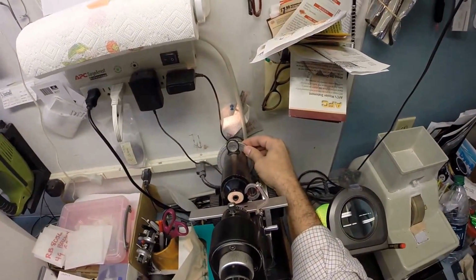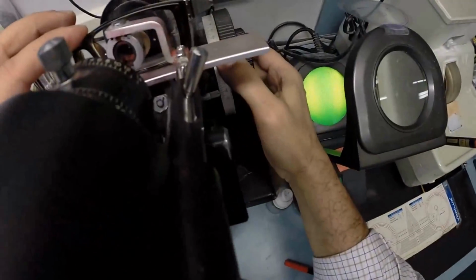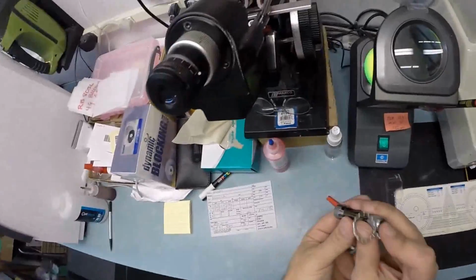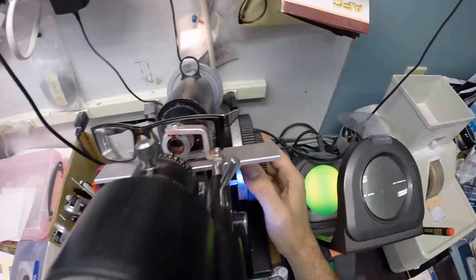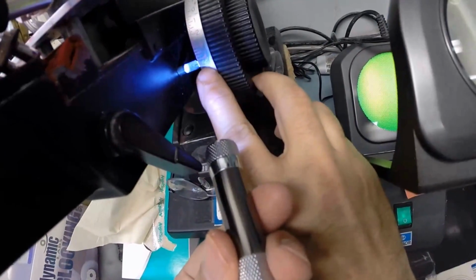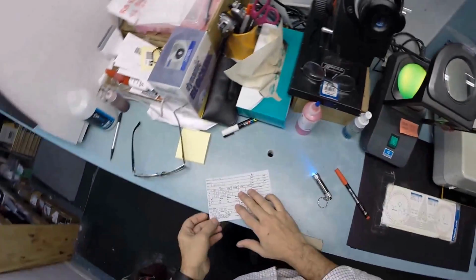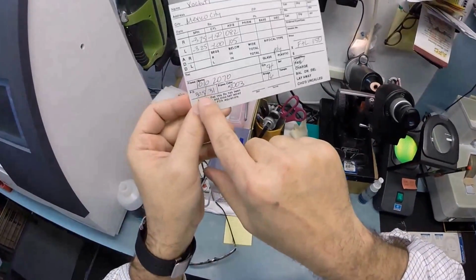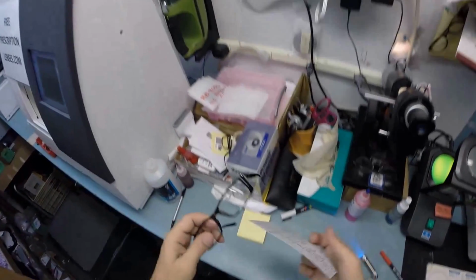So we're going to put the left lens in. We're going to turn the axis to 105, put it in just above that white dot, and when I check, we have -3 1/4. I'm going to turn the knob, and with the astigmatism correction, we're at -4 1/4, so that is made perfectly. Your pupillary distance is 30.5 for your right eye, 31 for your left, so a total of 61.5.